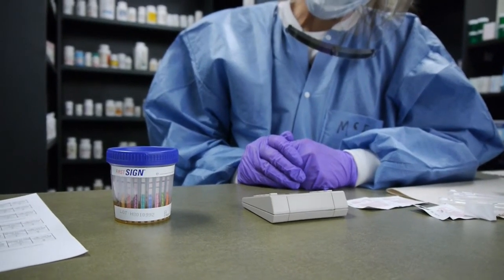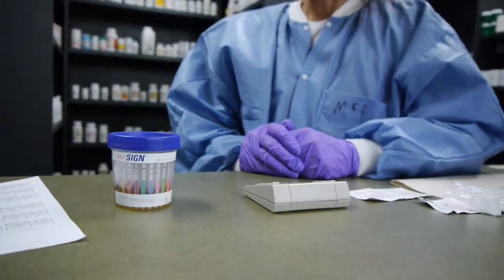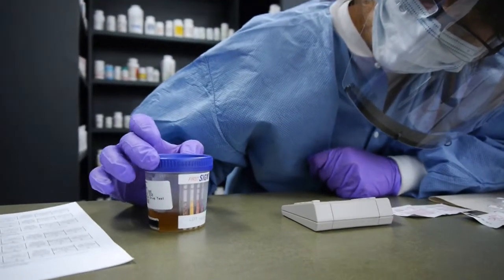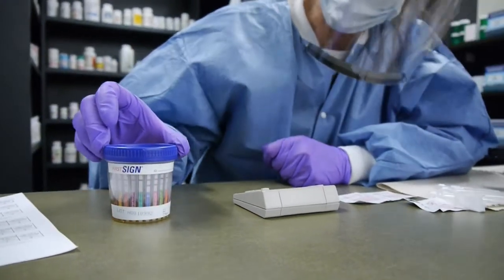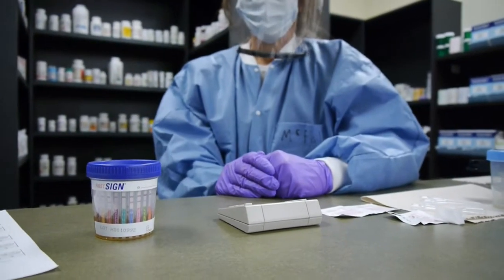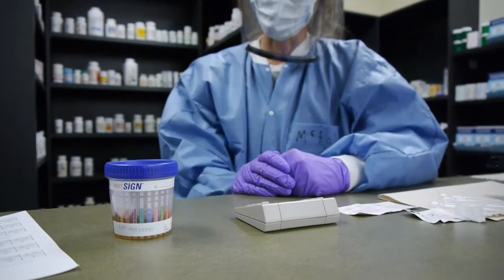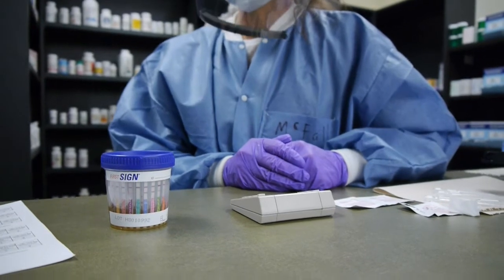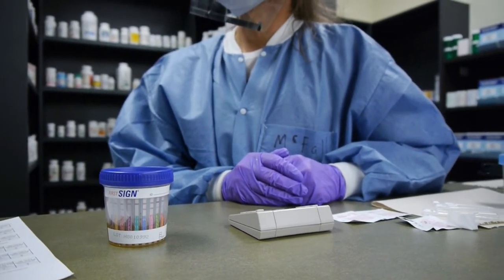We still have a minute and a half to go before we can read it. Even though we're speculating, we have to read it at the full five minutes. If you have a positive test, then you would go to confirmation testing. That is mass spec.